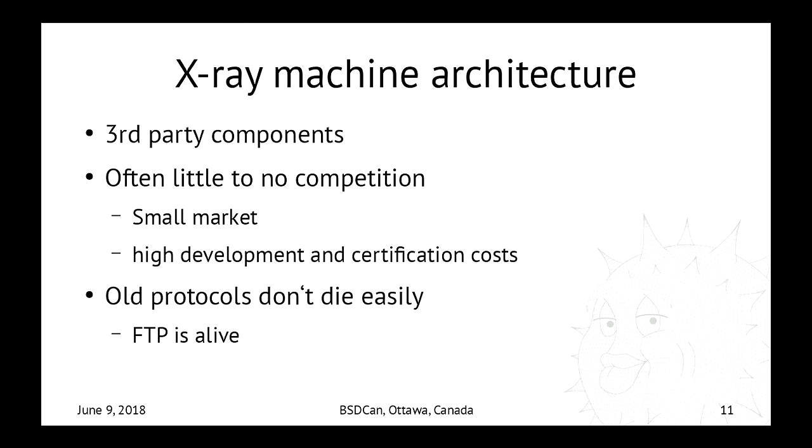For the vendor, another challenge, or actually a big challenge, is that a lot of the components inside are actually third-party components, which means very limited control over them. And for these components, there often is little to no competition. Of course, it's a small market, and there's very high development and especially certification costs, which in turn makes them not very eager to change things either. So this is a nice collection of old protocols. FTP is alive. Very alive.